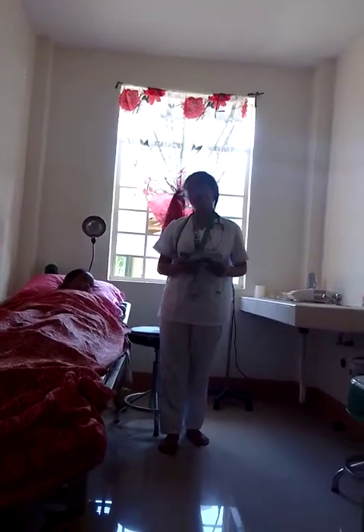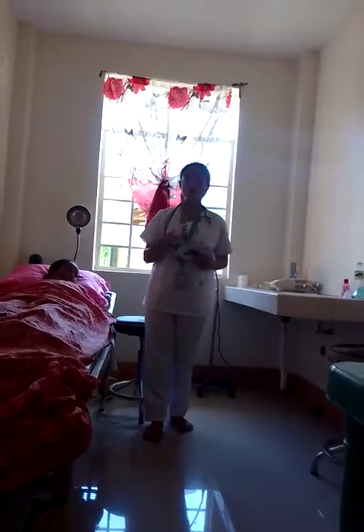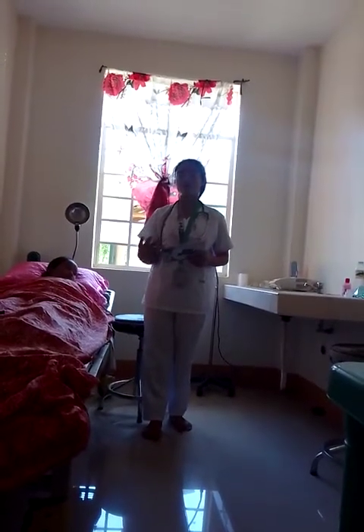So, after that, the record is there to know that the medication has already been given to the patient. The patient's reaction is very important so that the next shift can evaluate. If the patient experiences difficulty, or has questions, then we need to inform the doctor as soon as possible so that we don't have problems.